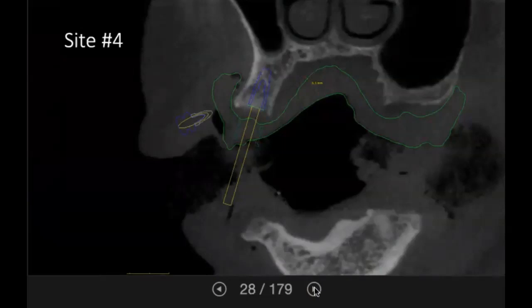The maxillary denture outline is shown here in green. Note the ideal adaptation of the intaglio surface of the denture to the soft tissues. Any voids between the denture and the soft tissue will result in guide fitting inaccuracies and implant placement errors.